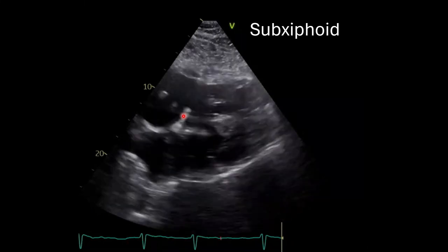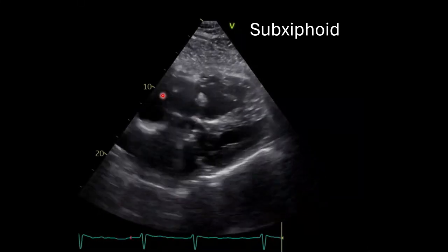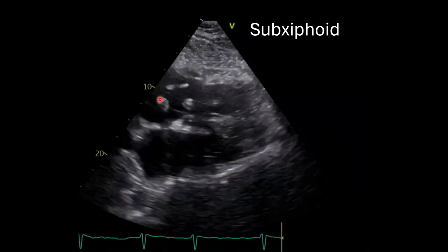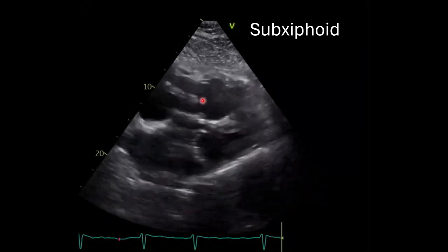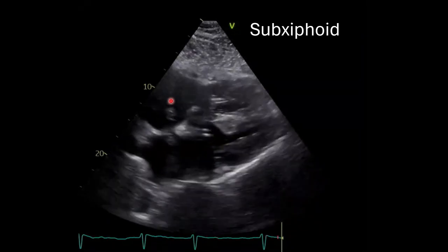And finally, in the sub-xiphoid view, you'll notice again an echogenic mass in the right atrium that's prolapsing into the right ventricle.